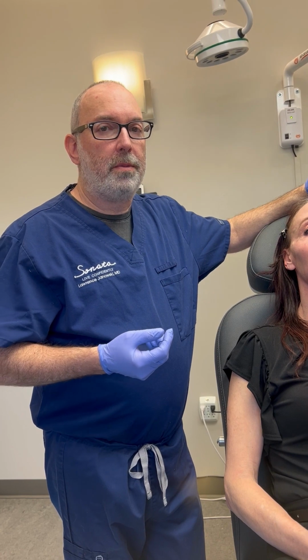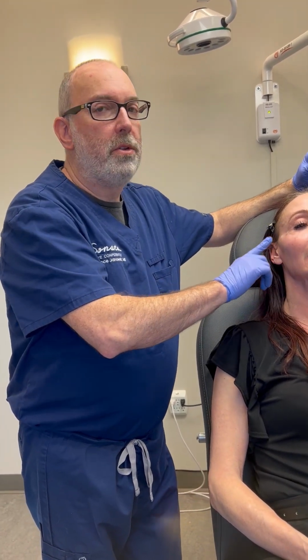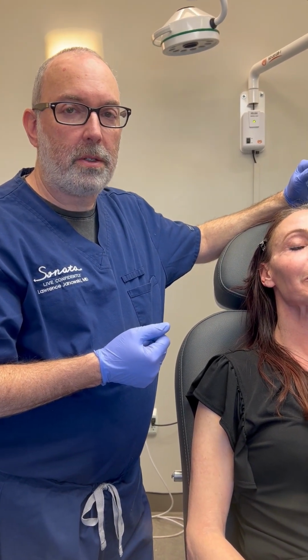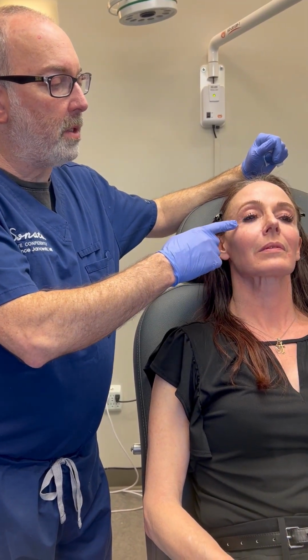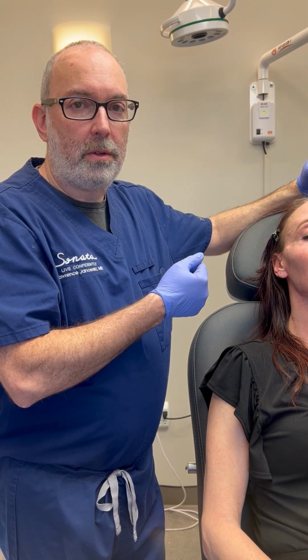Jeanette has had all these products before, but she's getting hollow in the usual places, and she's a really good Sculptra candidate. We've done many Sculptras in the past, so we're going to do some more today. And then again, we'll do lips, and she just has a little bit of hollowness in the under eye, not a lot. So I will show you how to do all those things.